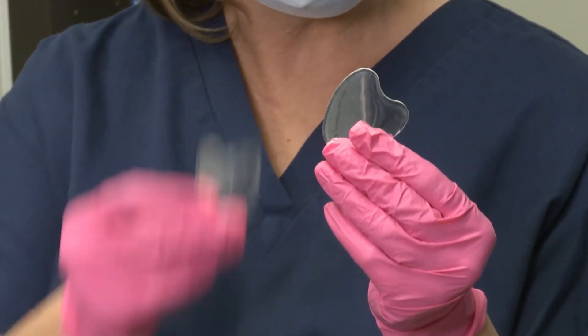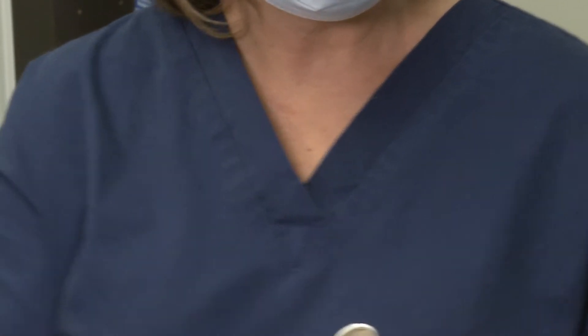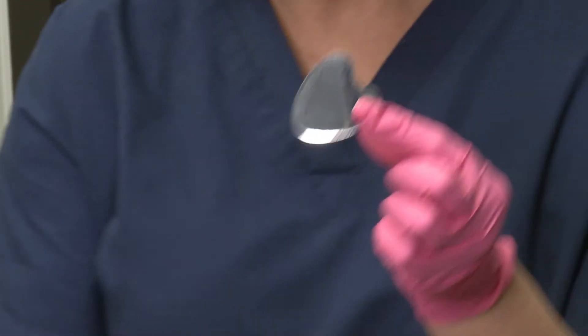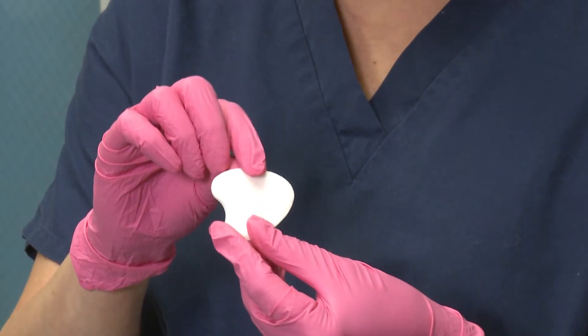The retractors come in two sizes, a large and a small. Dentists love the fact that the mirror-like reflective film illuminates the mouth while the absorbent side doesn't swell up or compromise the workspace.